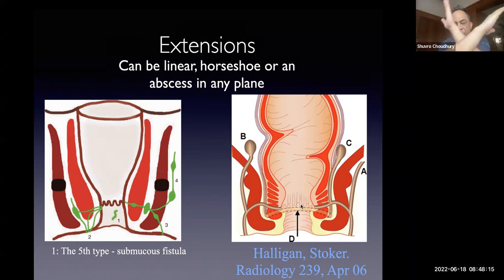And on MRI, you will always see a cross-reference point. On this coronal point, where does it correspond to on the axial point? So if you can see the coronal internal opening, put your cross-reference, it will show you where the axial opening is. Okay? So this is your first thing.